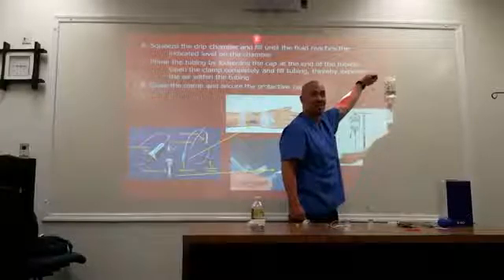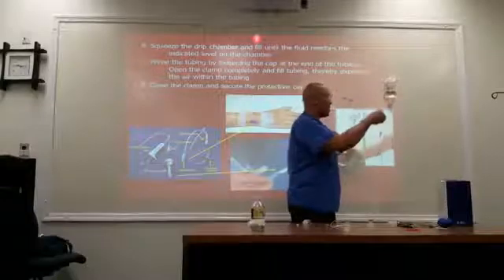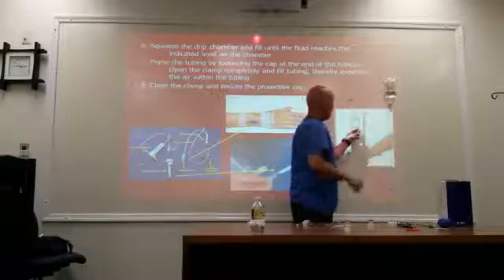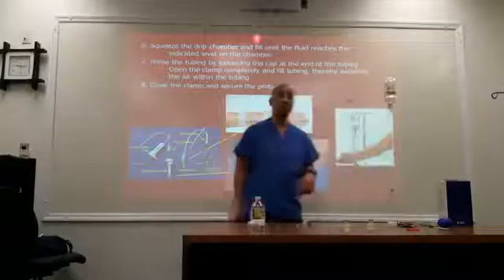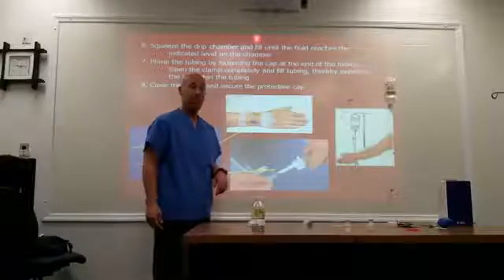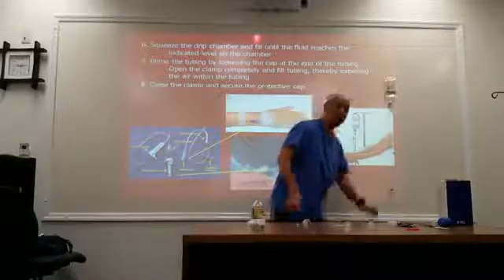Once I've purged all the air, what I'm going to do here is fluid on fluid. Then it connects, and I'm good. It's actually dripping. It's good to go. Is it okay to do it like you did right now, purging it and then connecting it? Yes. But before, make sure the doctor's there.